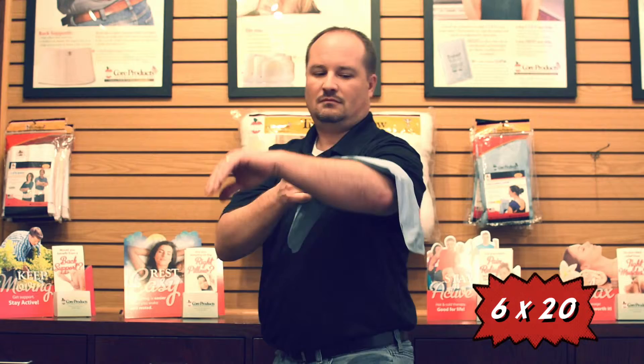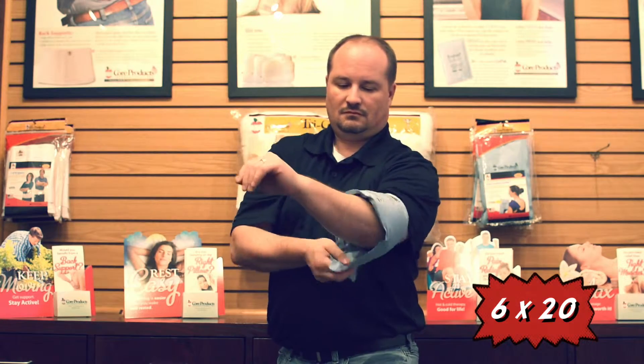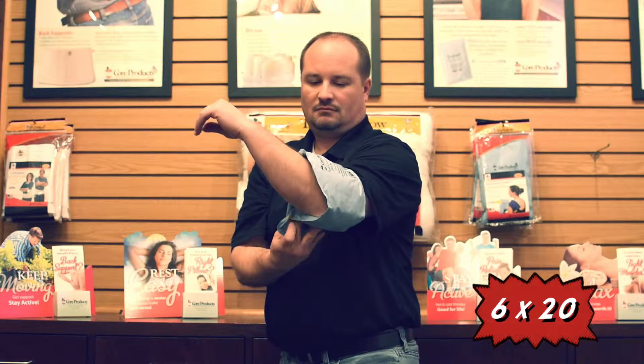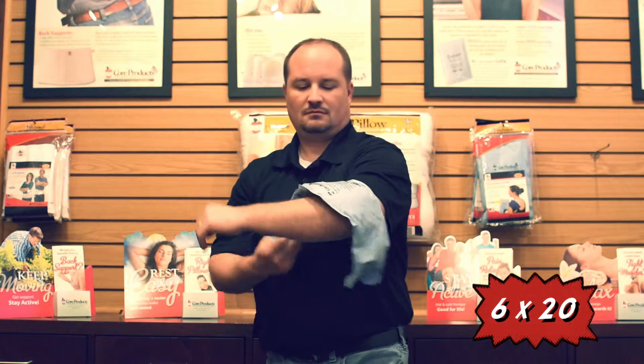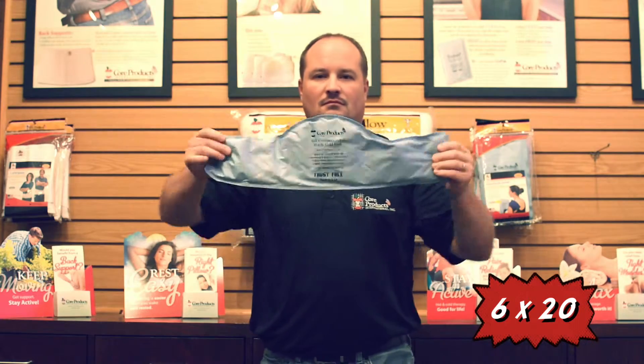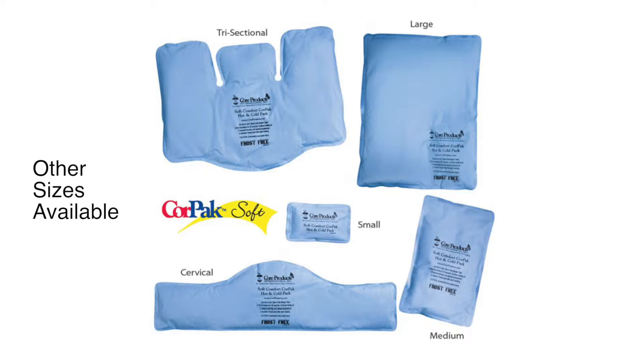The plush surface provides slow release therapy for sub-acute injuries, while the rapid release surface helps deliver cold therapy quickly for acute injuries. Packs can be warmed in the microwave or cooled in the freezer. The soft, frost-free pack is gentle on the skin and does not need to be wrapped in a towel.